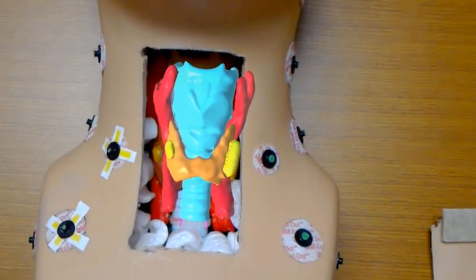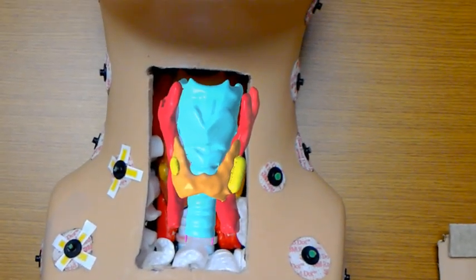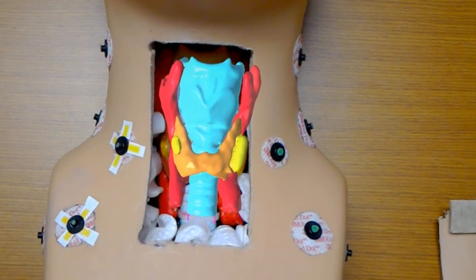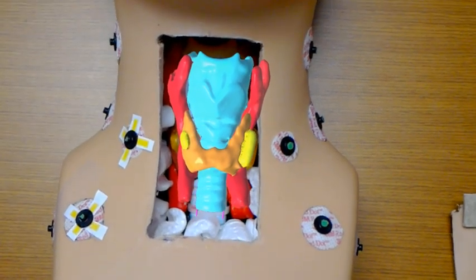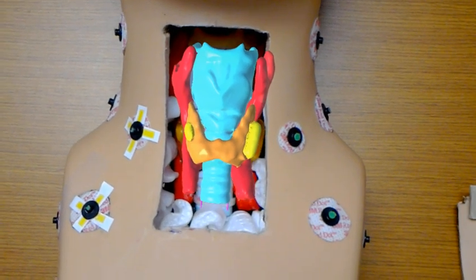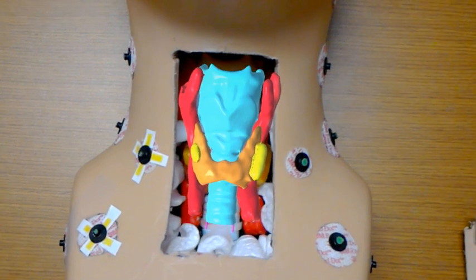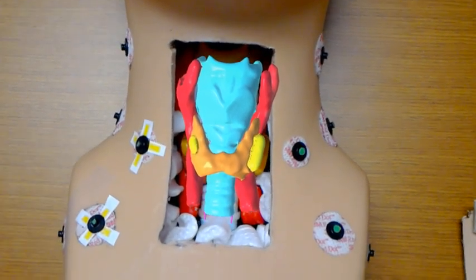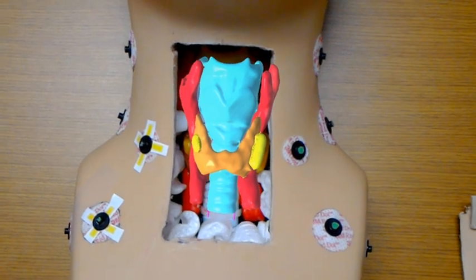And so now we have all of our virtual model represented there. I'll do one last little bit of toggling of the dimming, sort of up and down. But I think this gives you a pretty good idea of what we've been working on and some of the potential applications for augmented reality in the operating room, whether it's localizing pathology, tumors, lesions of various sorts, or helping to protect normal anatomic structures.